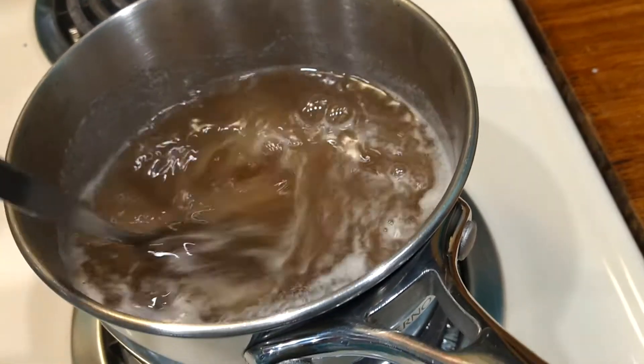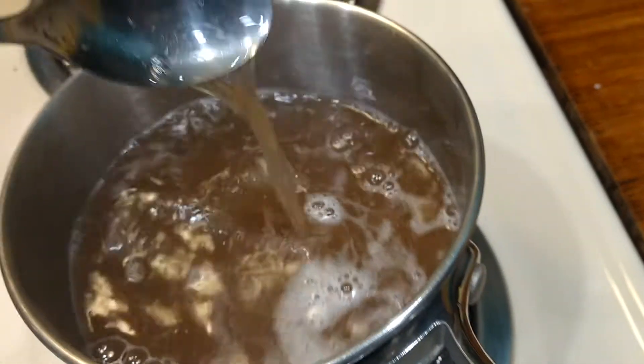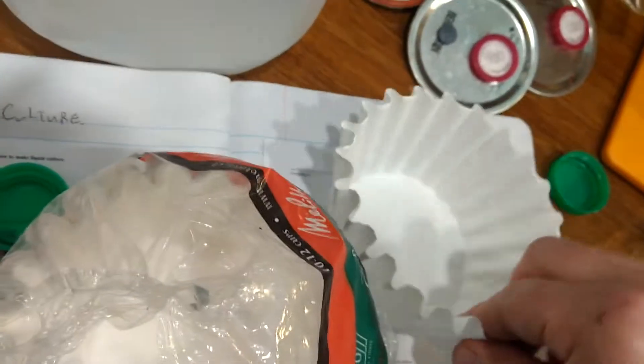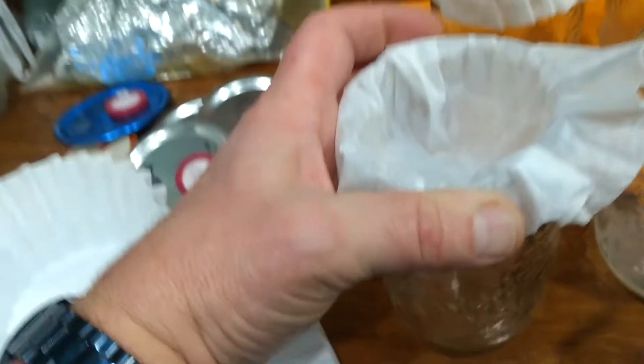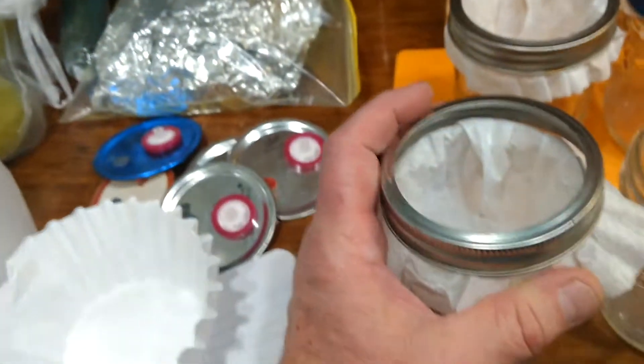You want to dissolve it on medium-high heat, and when everything is dissolved, get your coffee filters ready. You put them in the jar, you fold it over, you fan it out, you put the ring on, and you make sure there's a little bit of a dip in it.